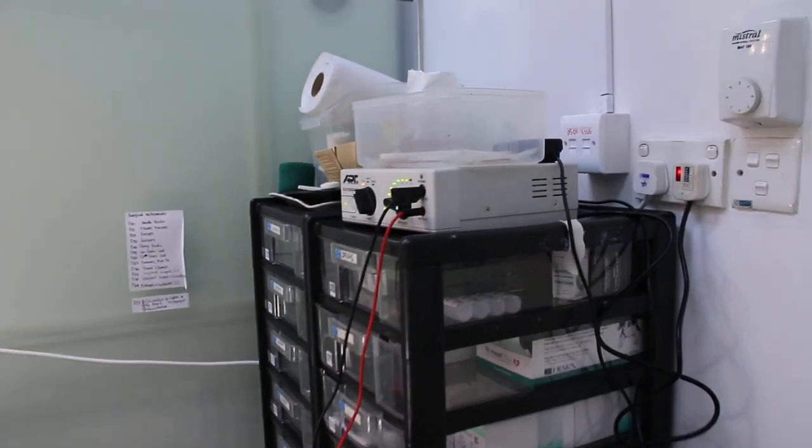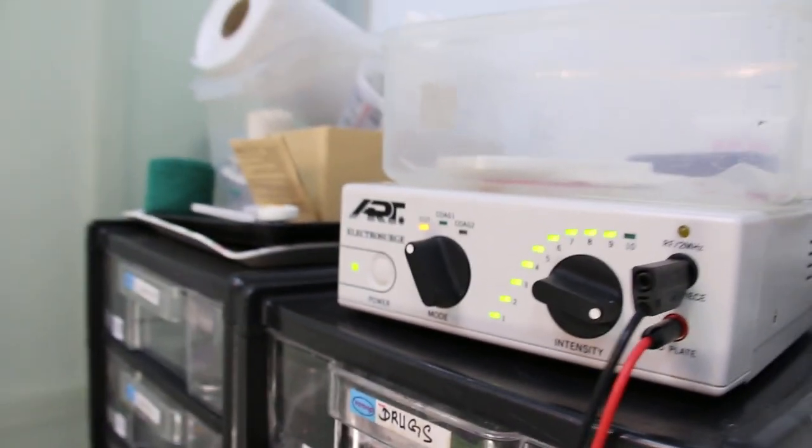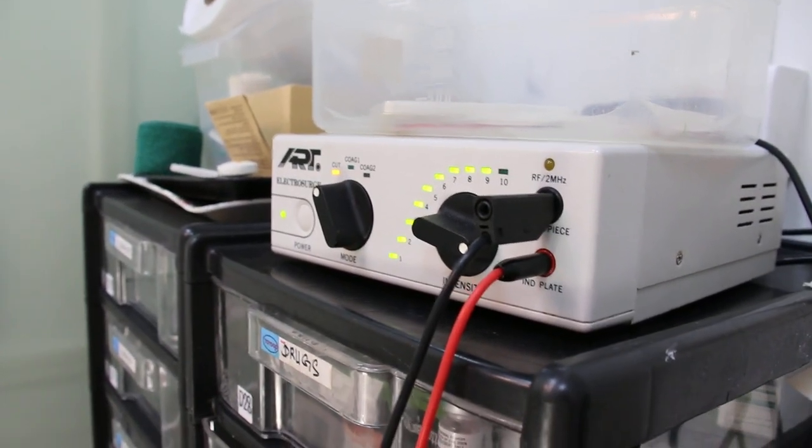Today is Sunday, February 25, 2018, about 10:30 a.m. We are doing anesthesia on this hamster. 7-month-old male, quite a bit plump, 54 grams.